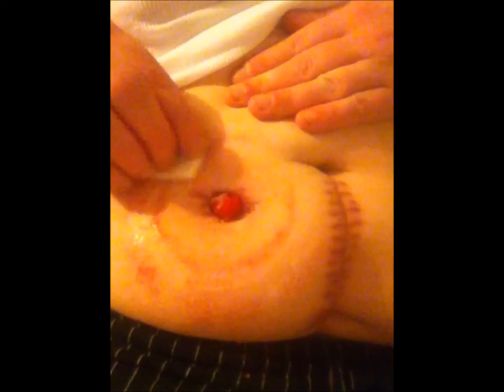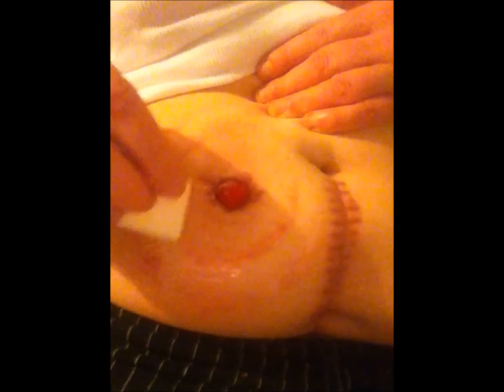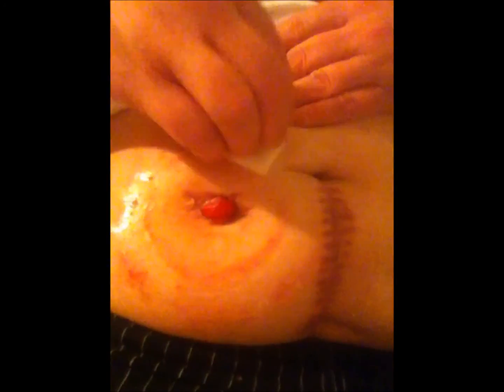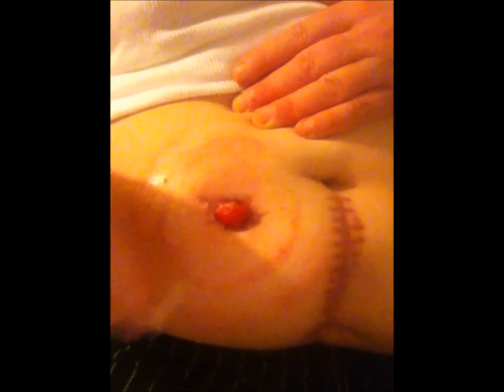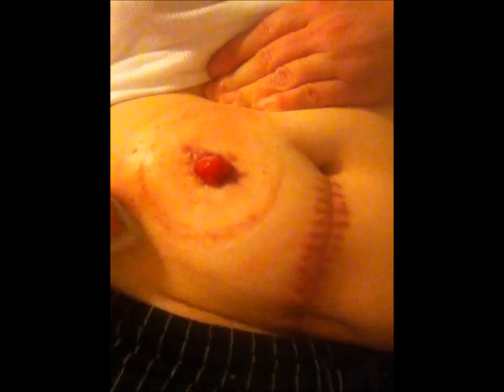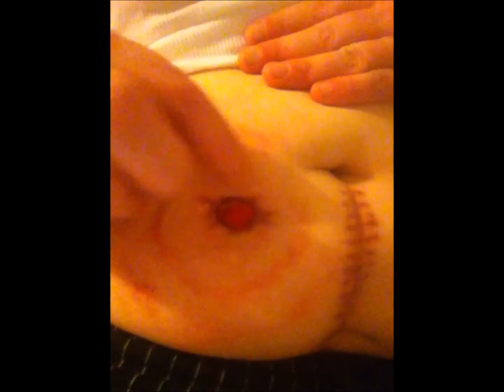That way the irritation that you're seeing with the ring, it doesn't hurt me, it just irritates a little bit. So if you put this stuff on, that will put a little Band-Aid on there, so the next time you put a wafer on, it doesn't hurt and it gives it a chance to heal. So now I've done that, I'm just going to wipe around the edges, make sure that's good. Like I said, don't worry about a little bit of powder on your stomach, it ain't going to hurt nothing. Now I'm just going to let that dry. I use my wafer to fan it. It's looking good. It's looking real good. It feels pretty dry now.